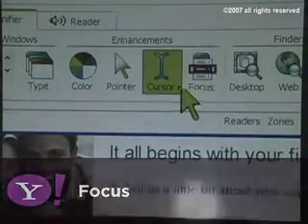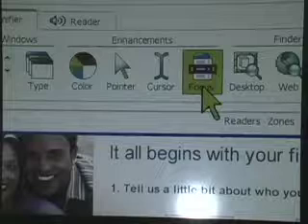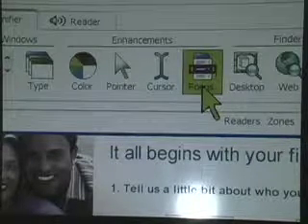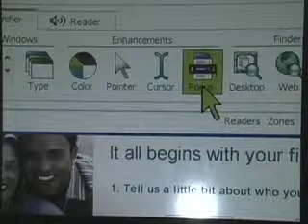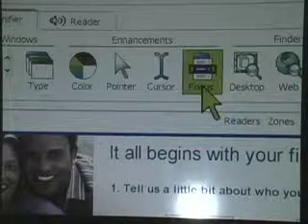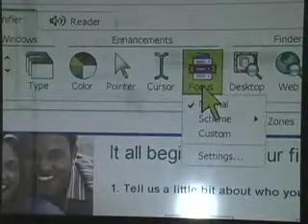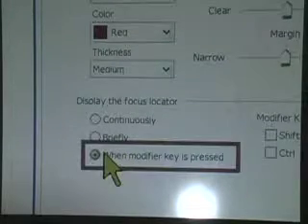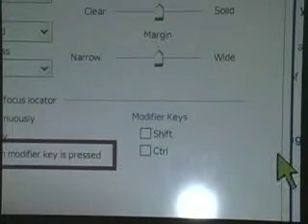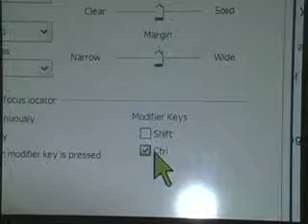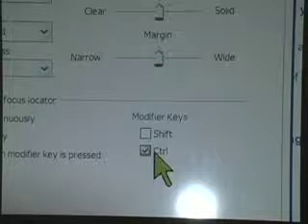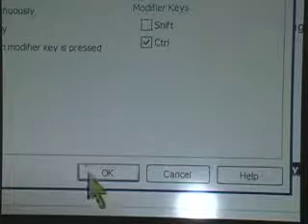Coming back to ZoomText — there is a wonderful feature that allows me to check the focus, so it's easier to identify where the focus is on the screen. My modifier key will be Control. Each time I press the Control key, I'll be able to find my focus, which is helpful. I pressed Control and I know exactly where my focus is. It's a small feature for some people, but it may be helpful for others, so it's great to have it.